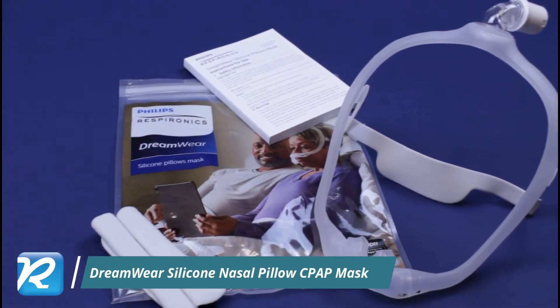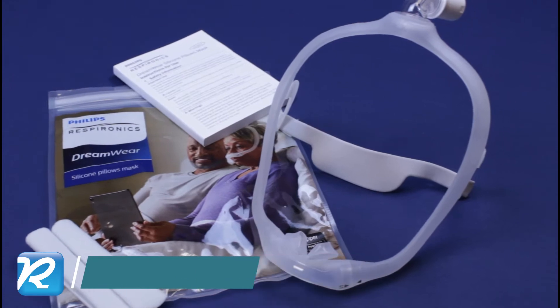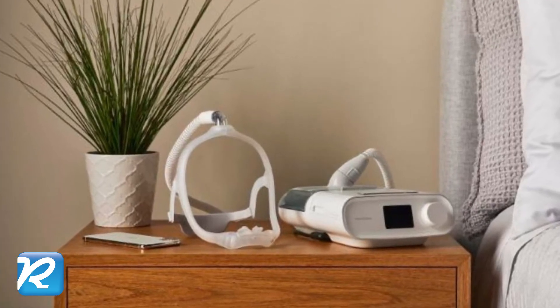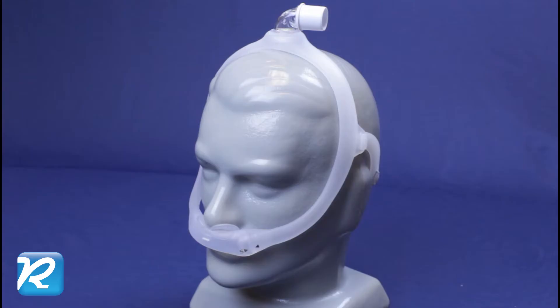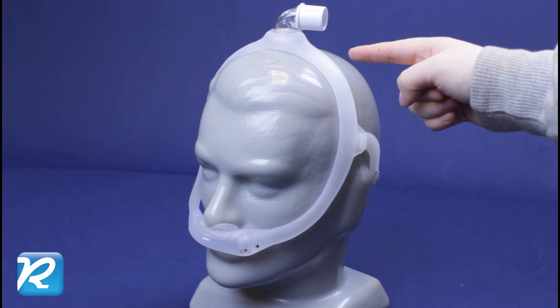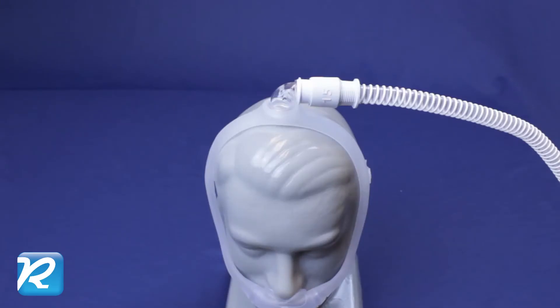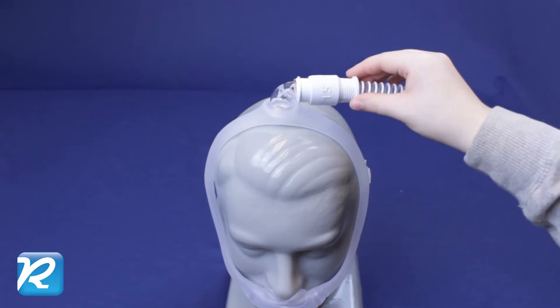The Philips Respironics Dreamwear Silicone Nasal Pillow CPAP Mask is the second generation nasal pillow mask in the Dreamwear mask family. All masks in the Dreamwear family use the same hollow soft silicone frame that rests to the side of the eyes. The CPAP circuit connects to a swivel adapter at the top of the head.